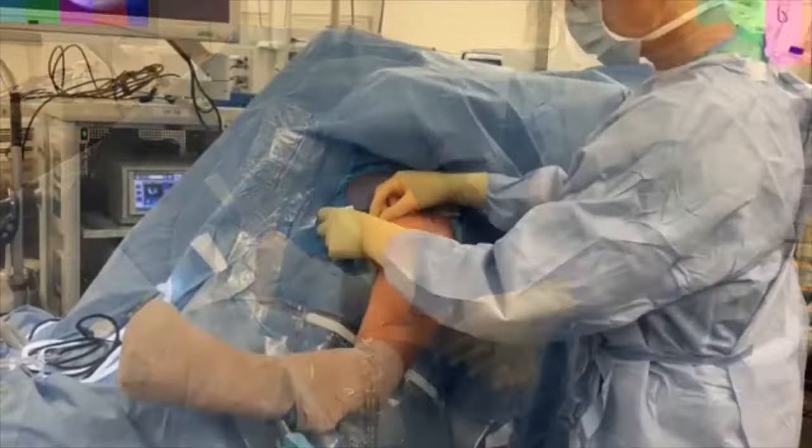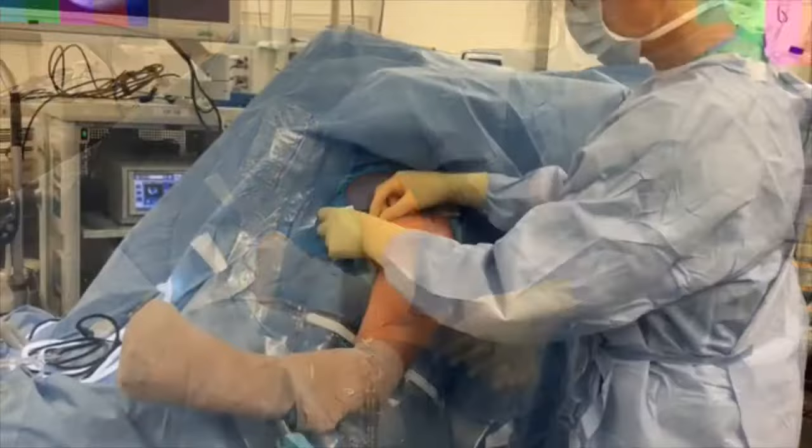The surgeon will then mark the landmarks of the acromion, clavicle, and coracoid, and then place ioband made by 3M Healthcare around the edges of the operative area. The surgical team will then change gloves and conduct a final pre-incision timeout.